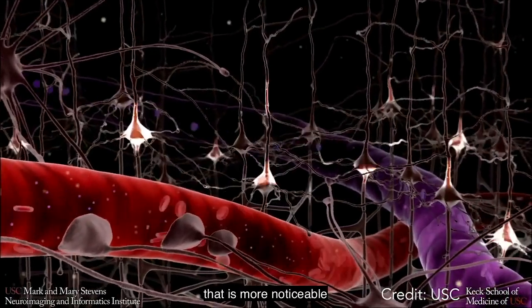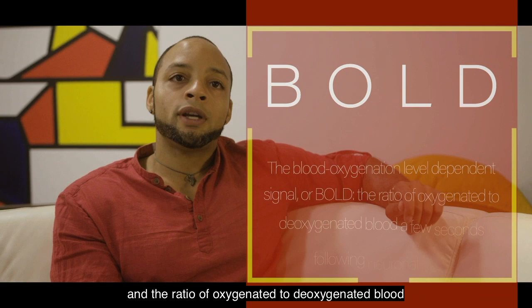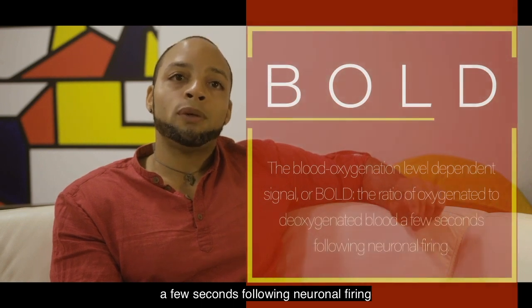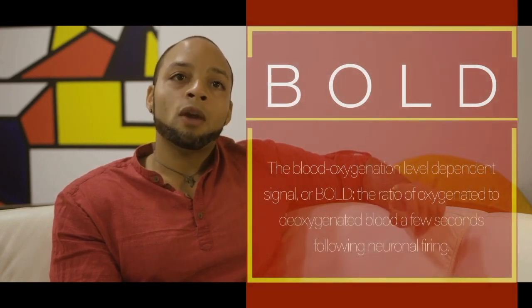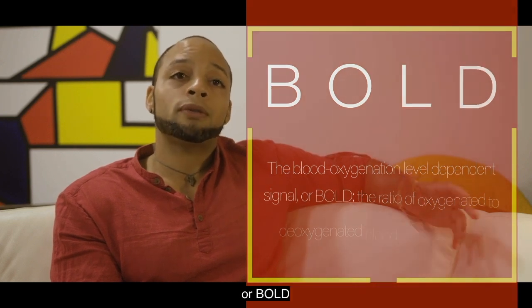that is more noticeable. So in fMRI, we measure the increase, not decrease, in the ratio of oxygenated to deoxygenated blood a few seconds following neuronal firing. We call it the blood oxygenation level dependent signal, or BOLD.